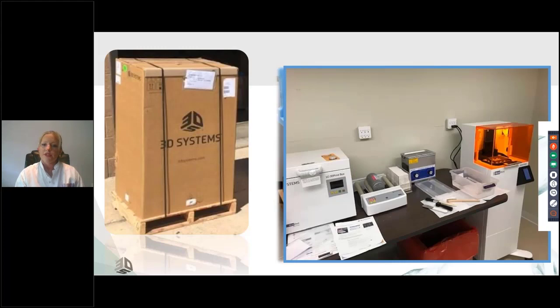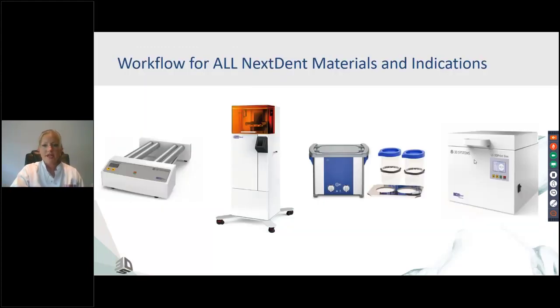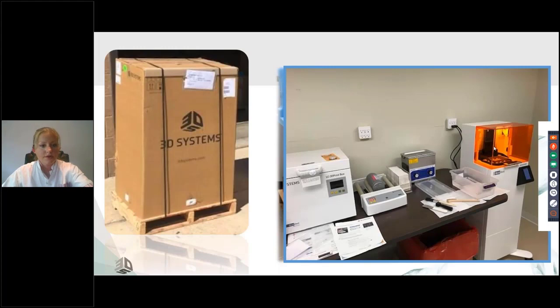And this is what your setup could look like, potentially. So if you wanted to have a long table or something like that, you can fit everything within about 4 feet. Some offices have, let me just escape out of this real quick.